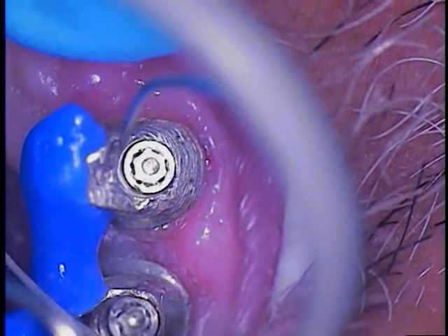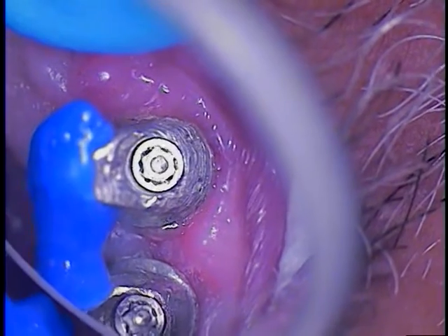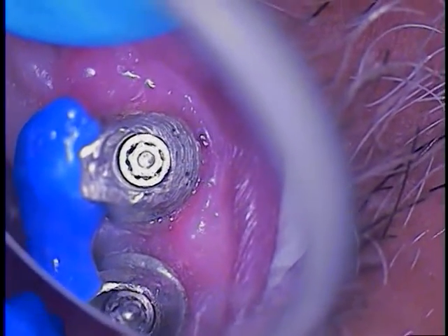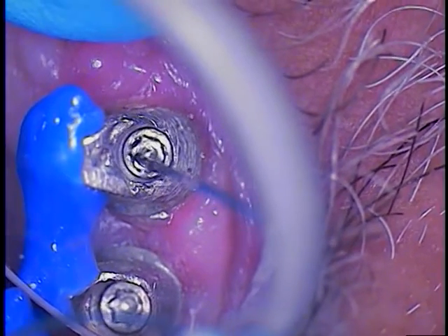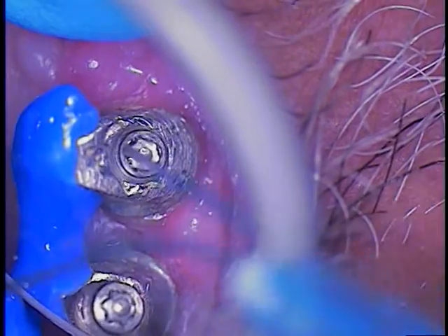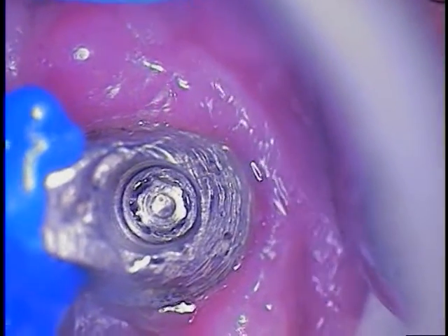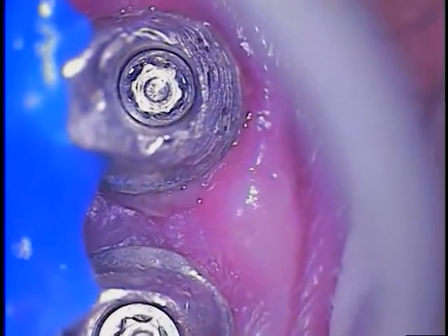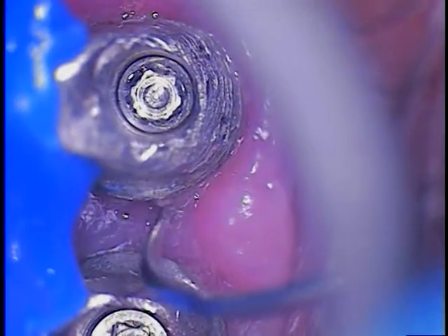Perhaps we can just leave this in place, take the screw out, clean the threads, and just put a new screw in and hand tighten only, and he's out of here. So let's continue to unscrew this ever so gently. I'm going to pre-soak it because there's probably all kinds of material. I really think the pre-soaking combination of fixing the implant to the adjacent tooth is, without a doubt, the best medicine for dentistry when you're doing cases like this. Now you can probably anticipate some of this clear material is going to start to darken, because now we definitely established a pathway around the screw head.